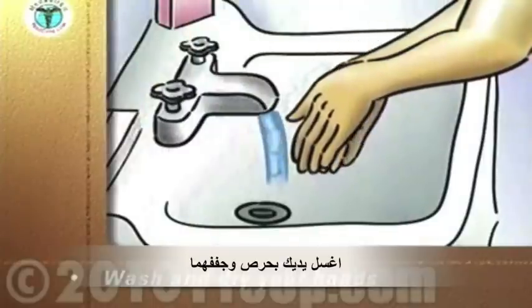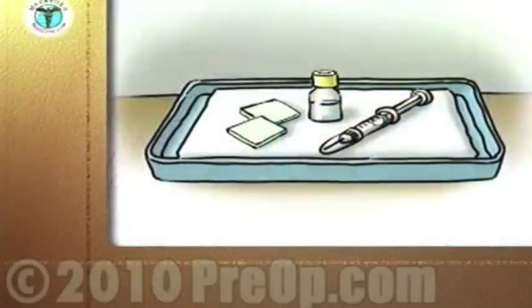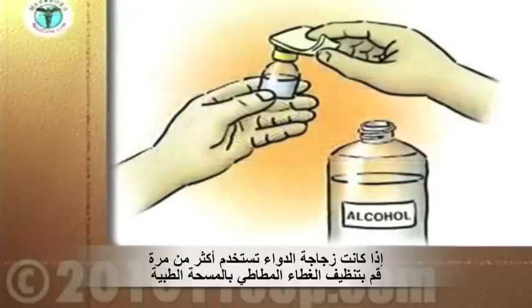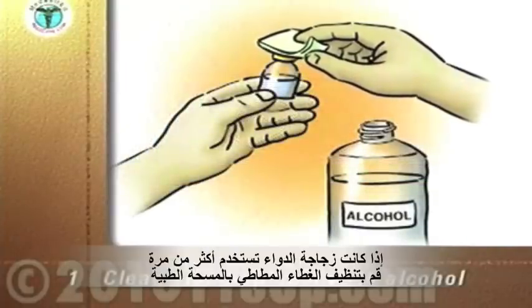Carefully wash and dry your hands. If your medication comes in a multi-dose vial, clean the rubber diaphragm of the vial with an alcohol wipe. Discard the wipe into the trash.